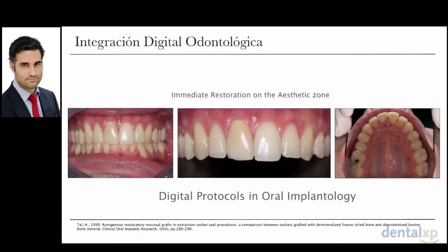As you can see, we are increasing the digital instruments, the digital protocol in our work. We started only with a CAD/CAM customized abutment. Now we are doing digital impressions, and we are doing a CAD/CAM provisional with a PMMA material. And right now we are going to improve this digital pathway, and we are going to increase the digital content in our cases.